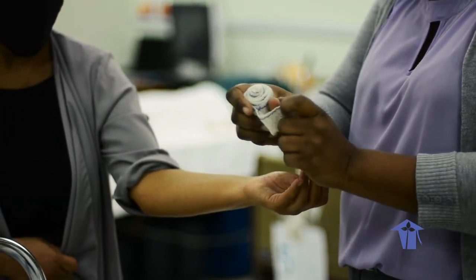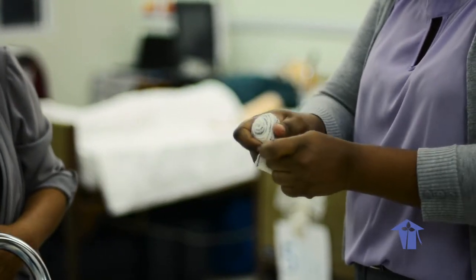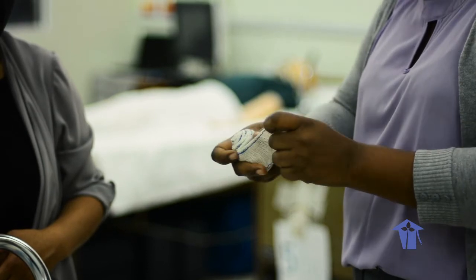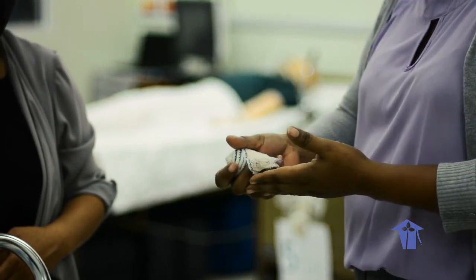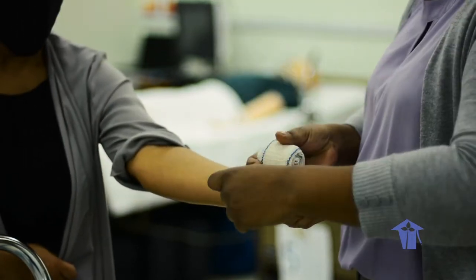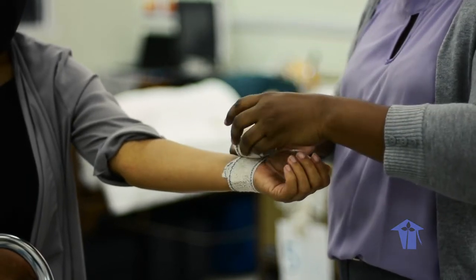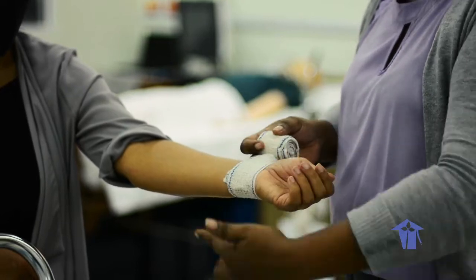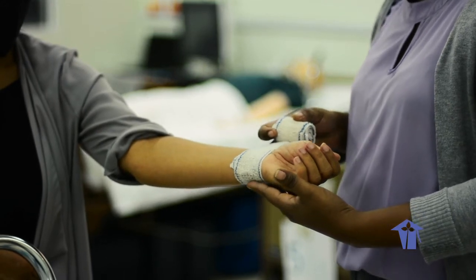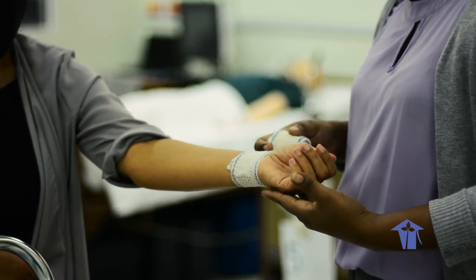The bandages are elastic cotton, so they have a lot of flexibility in terms of pulling and usage. The tighter you pull, the more compression you put on the wound site; the less tightly you wrap, the more comfortable for the patient. But it should never be so slack that it falls off, nor so tight that it restricts circulation. We call the first roll the anchor — it goes one turn completely over on itself so the bandage stays securely in place.